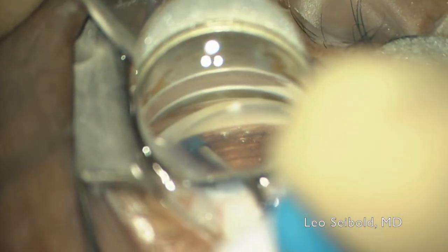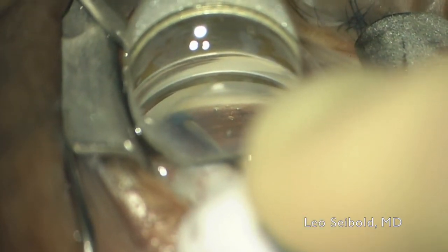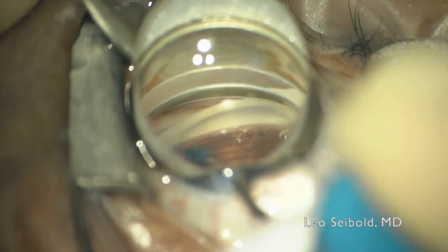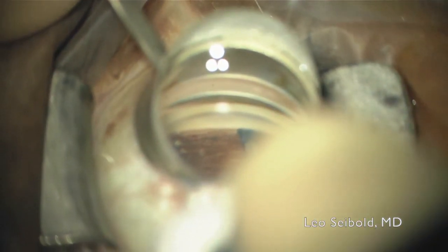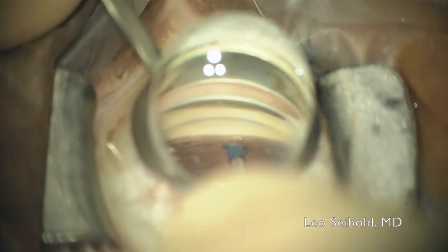I then can go to the side and perform another precision goniotomy and canaloplasty to the left of it and again to the right as well. The other nice thing about this is that doing this after the OVD injection helps to lift the TM and keep the incision well away from that anterior wall of the canal and prevent any collateral damage. The blue sleeve also is a nice guide to help keep you directed along the TM when you're sweeping left to right.